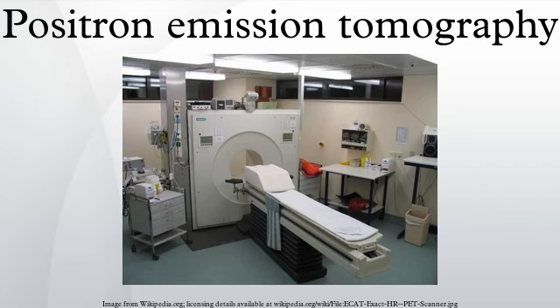Contemporary scanners can estimate attenuation using integrated X-ray CT equipment, however earlier equipment offered a crude form of CT using a gamma-ray source and the PET detectors. While attenuation-corrected images are generally more faithful representations, the correction process is itself susceptible to significant artifacts. As a result, both corrected and uncorrected images are always reconstructed and read together.